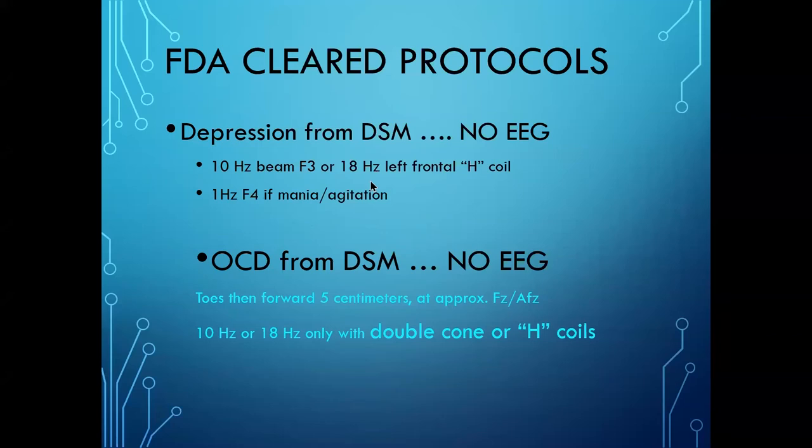I suggest looking. You know, my grandmother said, don't dive into the water unless you know what's under the surface. I think it is quite apropos for the use of EEG for TMS. Use the EEG to look what's under the surface. And if you've got left frontal resting state, fine. If you've got right frontal beta, you know it's there. You can target it. You can split your sessions on stimulation left and inhibition right.